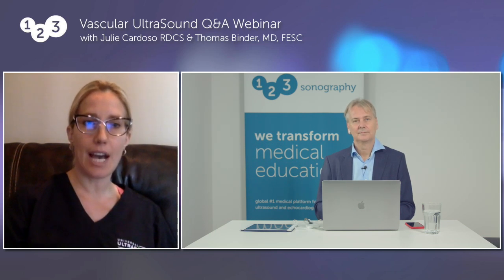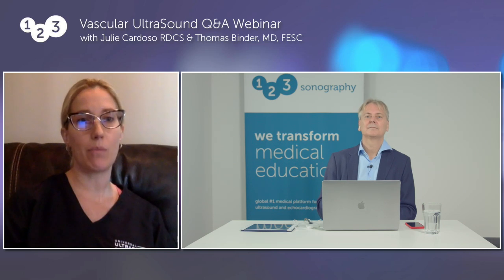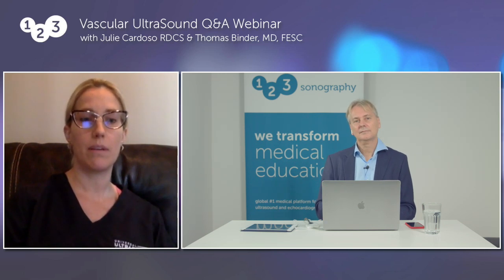Right. Do you also use any measurements? We only use measurements of diameter and time when we're assessing for insufficiency of the deep and the superficial system. The diameter measurements would be of the superficial veins, which would be the saphenous veins, and any perforators that connect the deep and the superficial system. We would use diameter measurements from the anterior to posterior wall of how big these vessels are. And then we would utilize spectral Doppler and measure the time of insufficiency in these particular veins. And then the time would be utilized in the deep system as well.